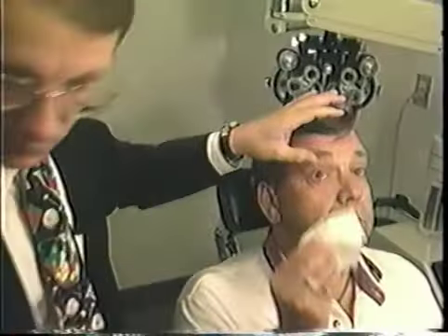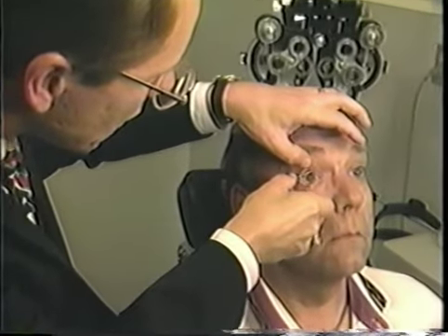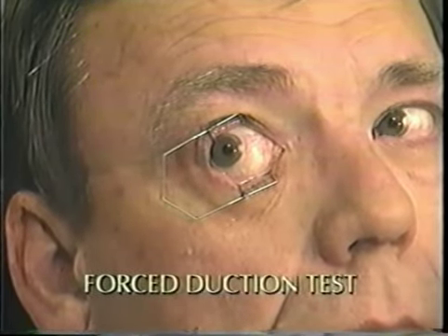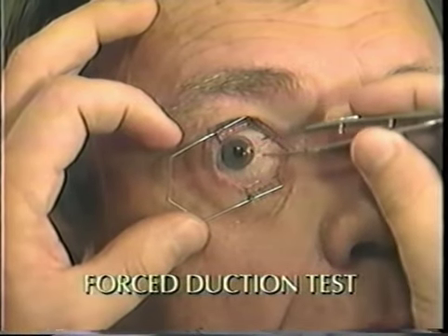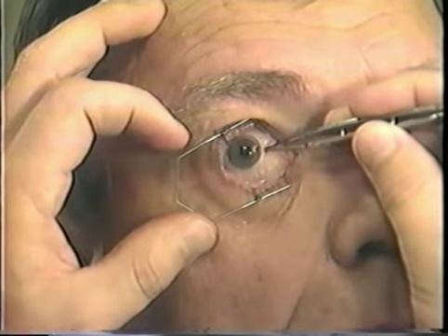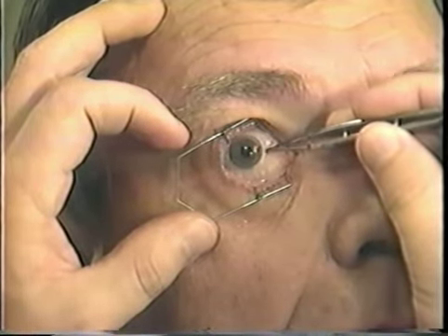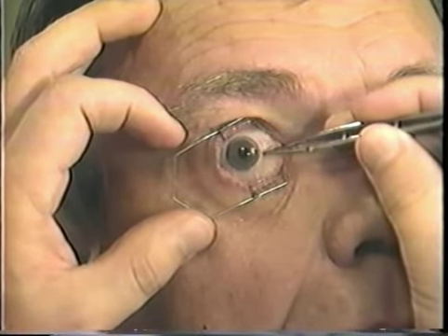To prepare the patient for forced duction and force generation testing, apply a topical anesthetic and use an eyelid speculum if necessary. Ask the patient to look in the direction of the duction limitation. Next, perform a forced duction or monocular rotation of the eye. Grasp the eye with a pair of toothed forceps near the limbus, 180 degrees across from the gaze direction to be tested. When testing one of the rectus muscles, proptose the globe slightly to put the muscle on stretch.